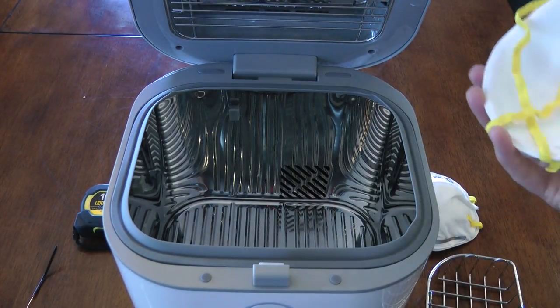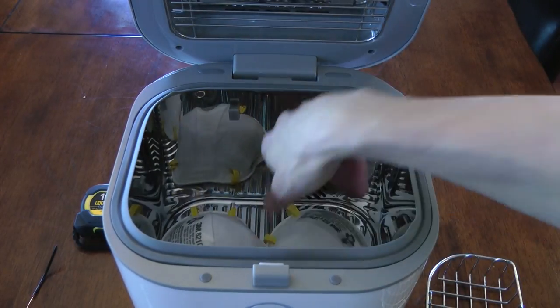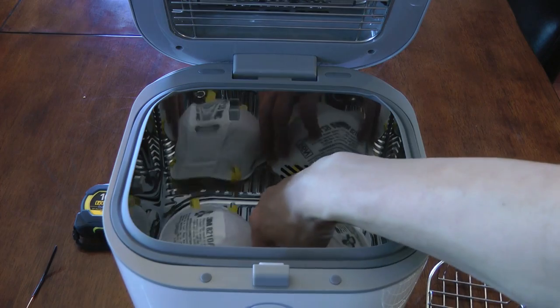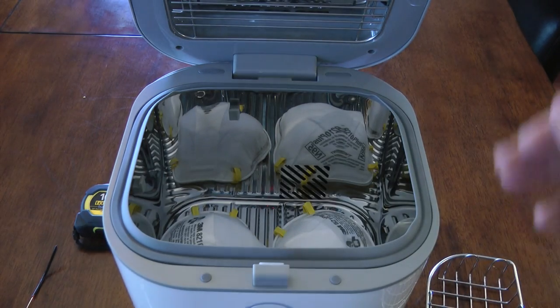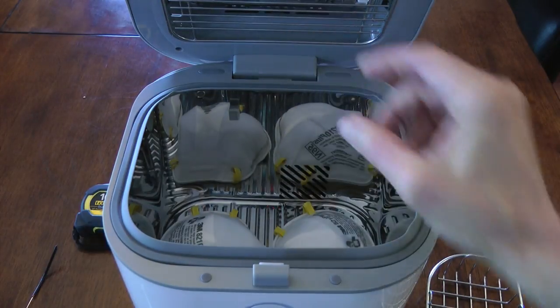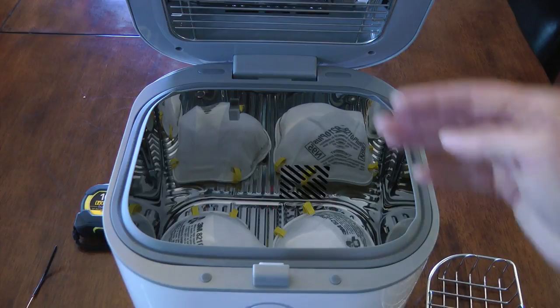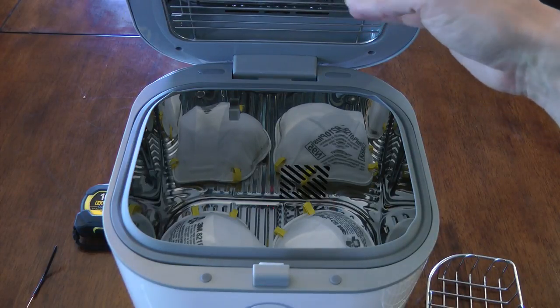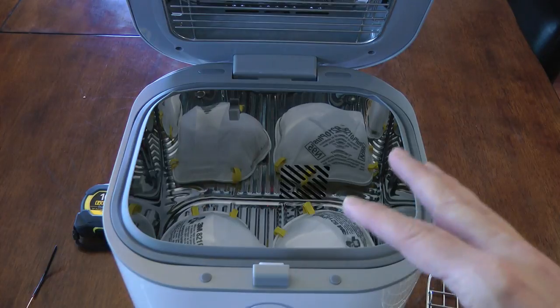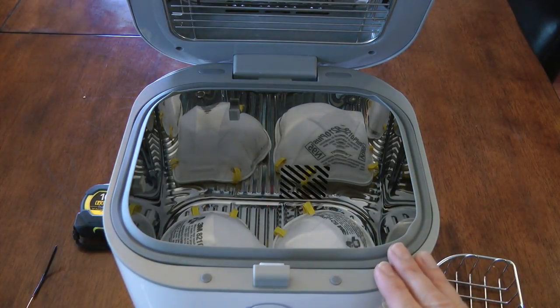Unfortunately, if we just take our N95 mask and set them down in the bottom, while they fit very nicely and you can get two masks in there perfectly, when you close the sanitizer they're at a fairly good distance from the bulbs — maybe on the order of six inches away. The intensity of UV light drops with distance very quickly, so we're really not exposing them to the maximum light we could in this chamber.